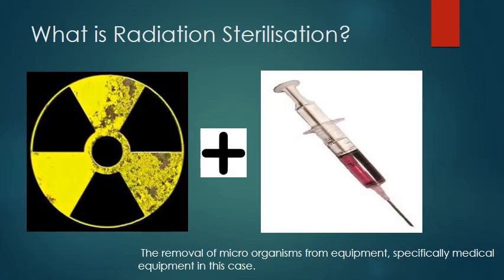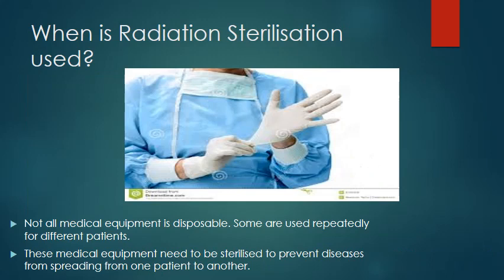Information on radiation sterilization. What is radiation sterilization? It is the removal of microorganisms from equipment, specifically medical equipment in this case. When is radiation sterilization used?